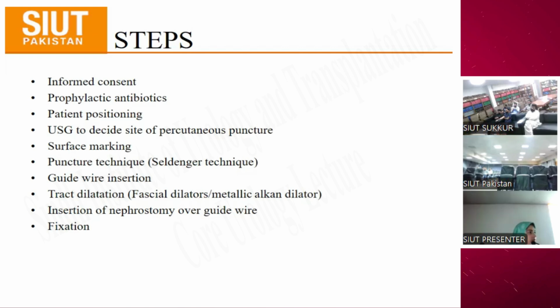Sir, it is a technique in which you puncture the organ, that could be the bladder or abdominal cavity or the kidney, and after serial dilatation with a fascial dilator, you insert it.